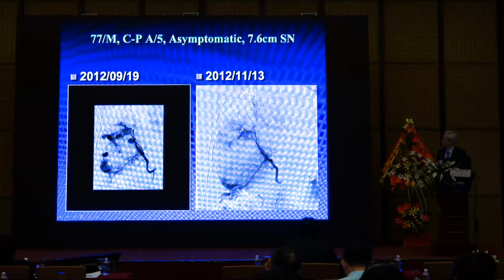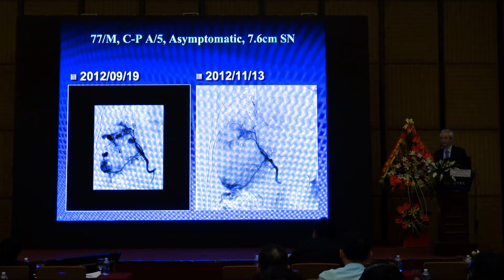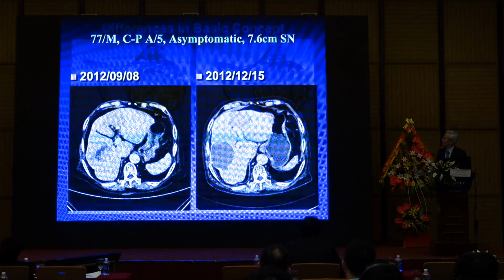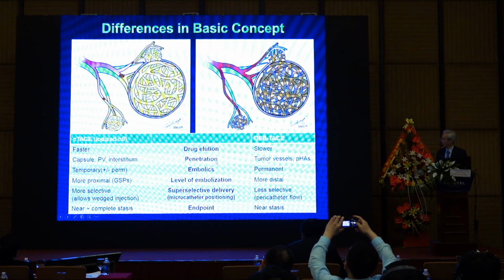And this is the follow-up angiogram without any further embolization. The blood pools disappeared and a small residual viable tumor remained around the tumor. So I repeated a second session of DEB-TACE, and the tumor was completely necrotized. If we compare conventional TACE and DEB-TACE, there are some differences.